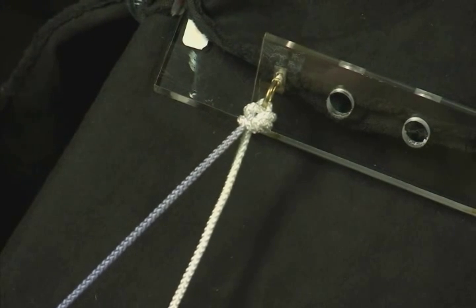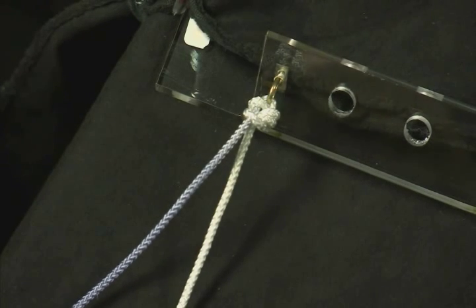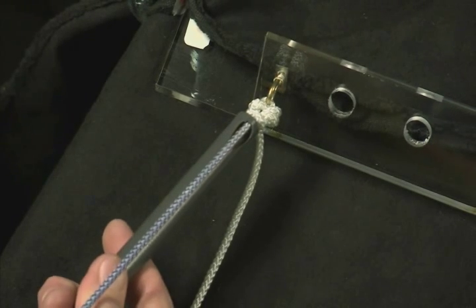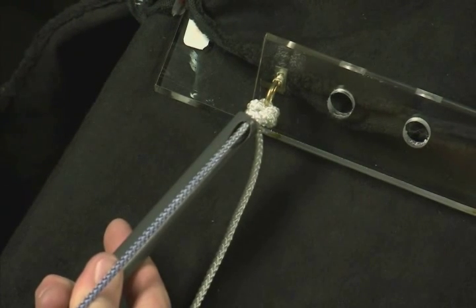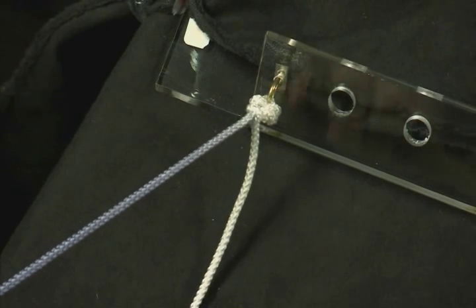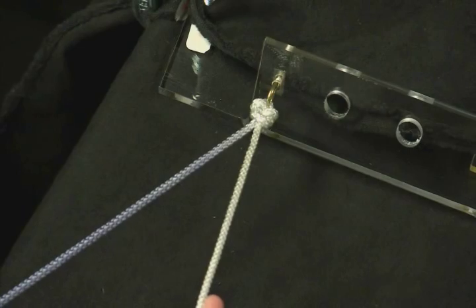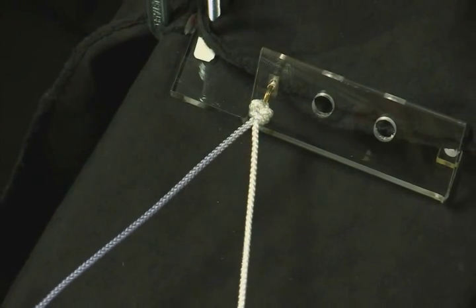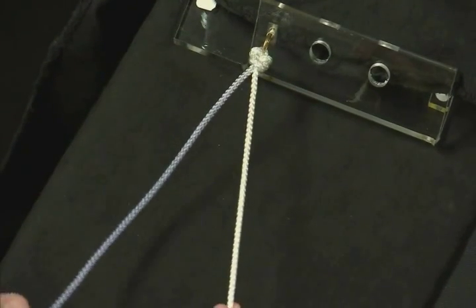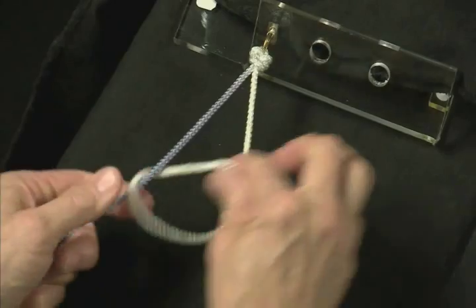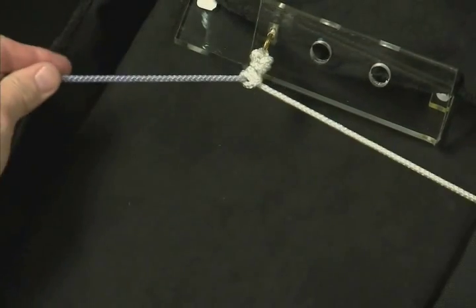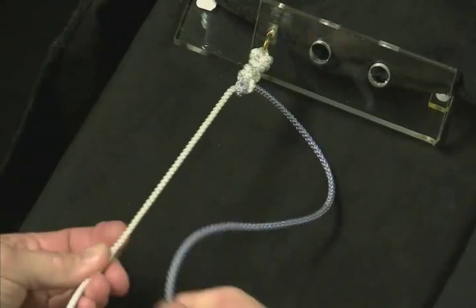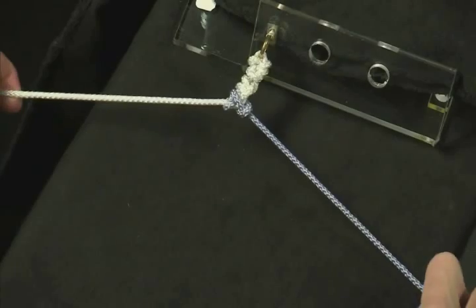And with suture, it pretty much seats itself all the way. You can certainly use a knot pusher if you want to. Again, you don't have to worry about the tension right now, but you want to put the tension on the post. And you can seat it like that. But then to flip it, all you do is pull on your wrapping limb, and that locks the suture. So this is a sliding suture, and now it's locked. You do want to put half hitches on it, but you don't have to worry about knot security. So with my half hitches, I'll go over, under on one limb, and then switch to the wrapping limb and go over and under. And then there's your finished knot.